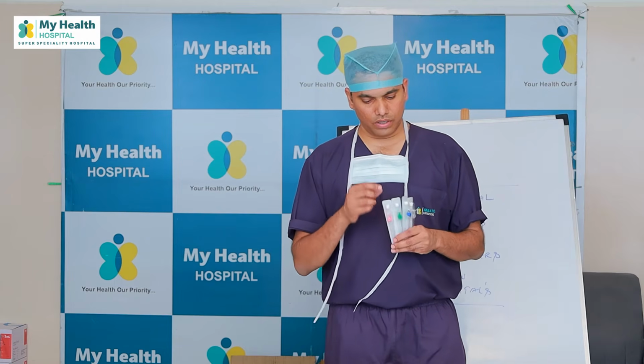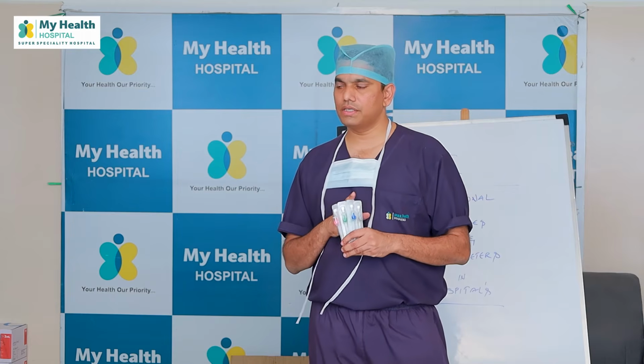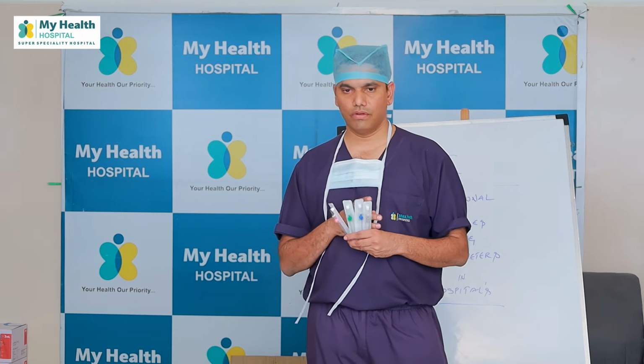And smaller the lumen, higher the chances of blockage. Because the vein caliber is low, there is a higher chance of blockage and thrombophlebitis. The moment we give antibiotic, titrate antibiotic and give, it might get blocked easily.